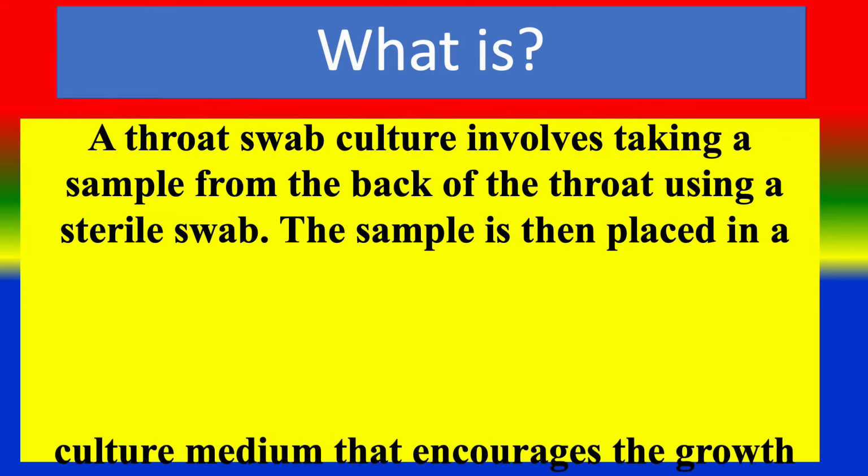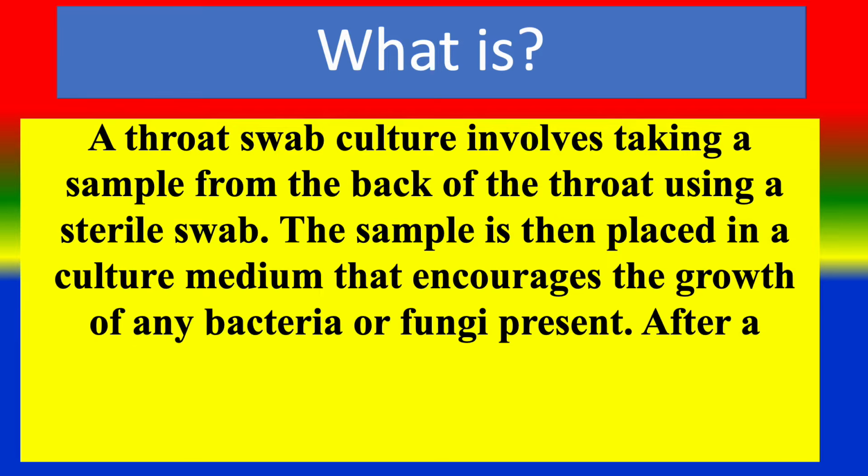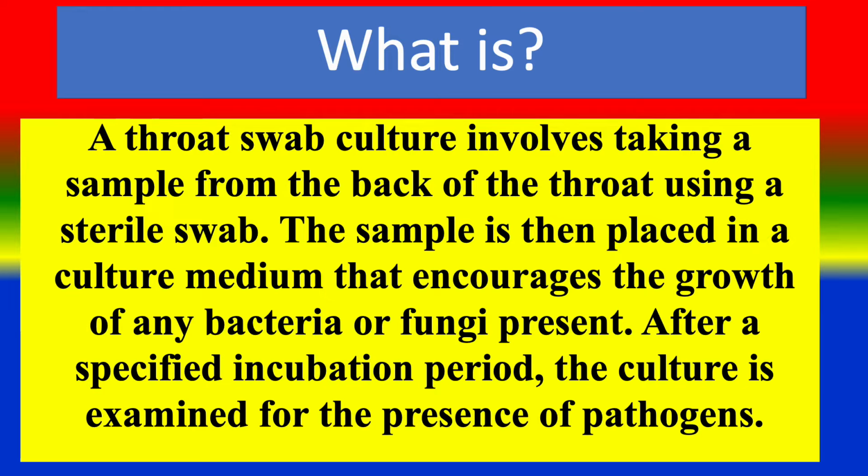The sample is then placed in a culture medium that encourages the growth of any bacteria or fungi present. After a specified incubation period, the culture is examined for the presence of pathogens.